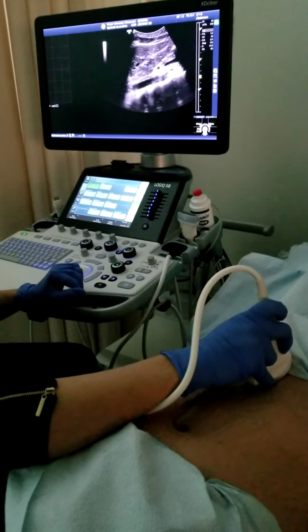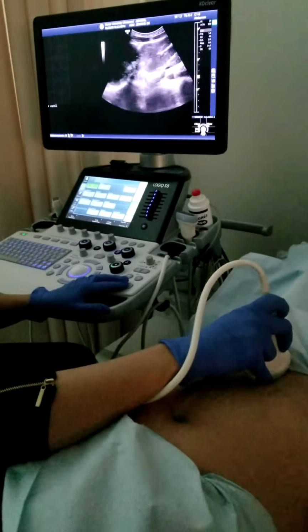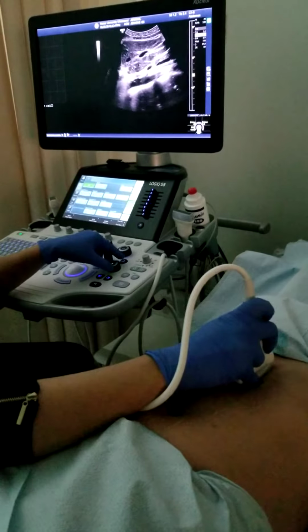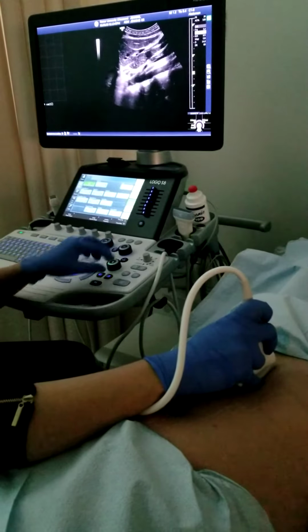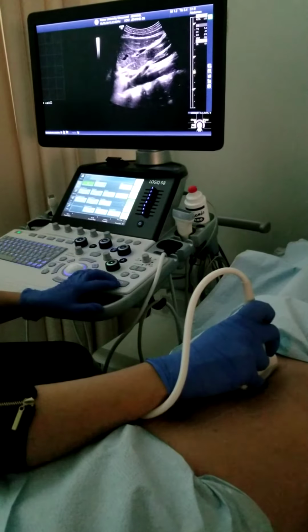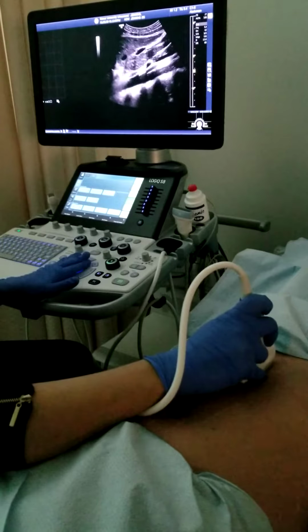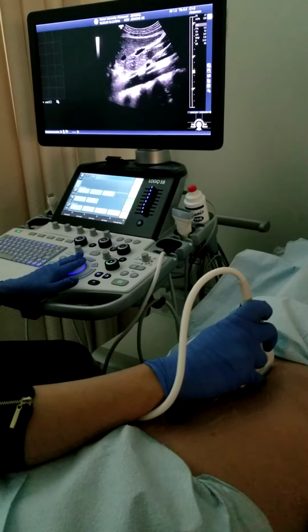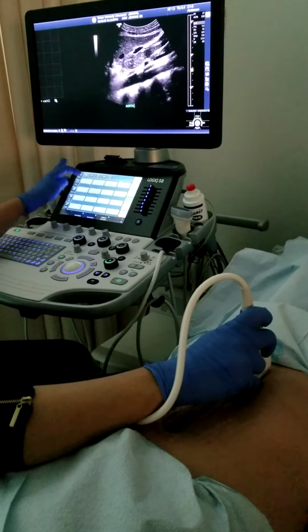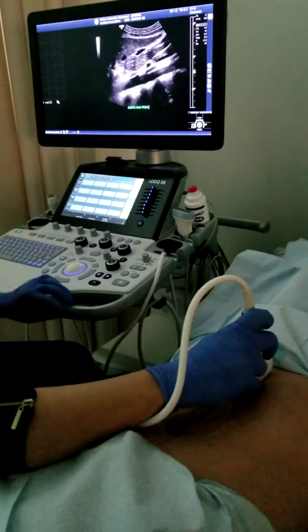So please take a breath in and hold it. When she brings that breath in, she's going to push that diaphragm down, and I'm going to see my proximal aorta a bit better. Once I like it, freeze. Okay, breathe. Label: Aorta, sag, prox.